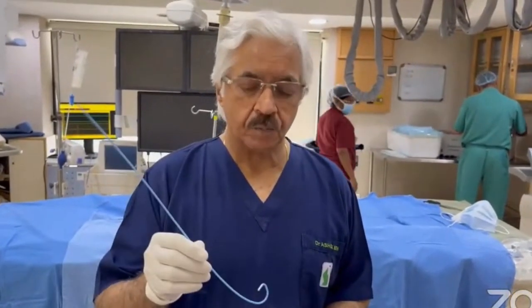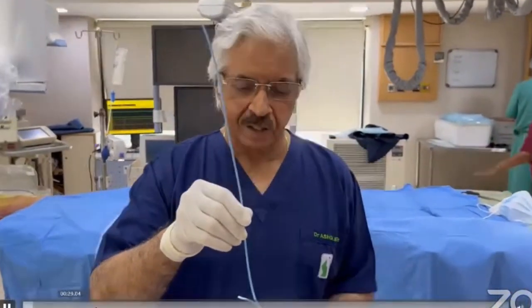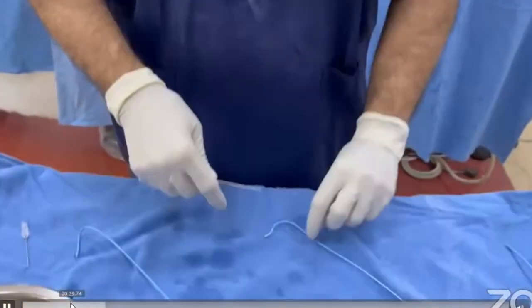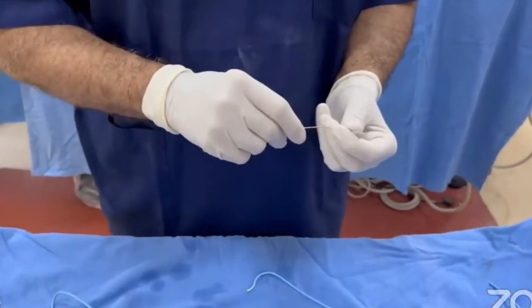I am a femoralist more than radialist, okay? Though I do radials, I do fewer interventions radially than femorally. But you're right, for anomalous coronary arteries, depending upon the variations and depending upon the changing of guides and the number of guide catheters one may need to use, modify, adjust, the same goes for diagnostic.